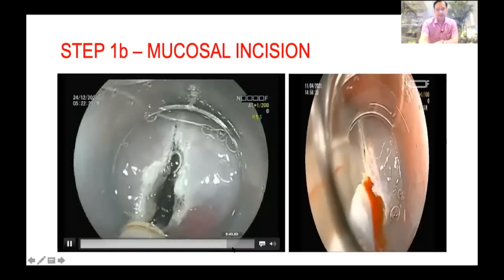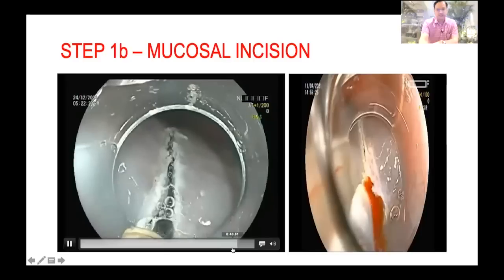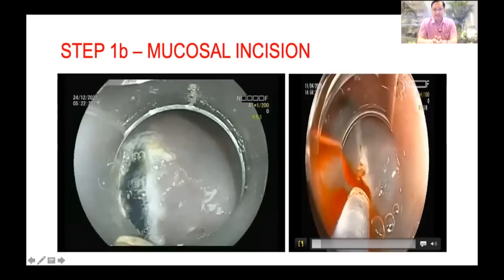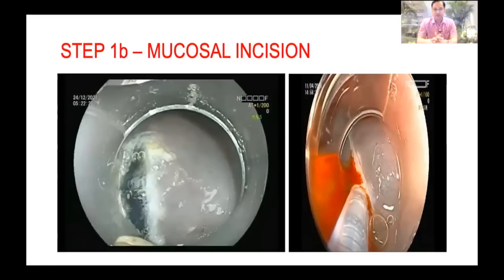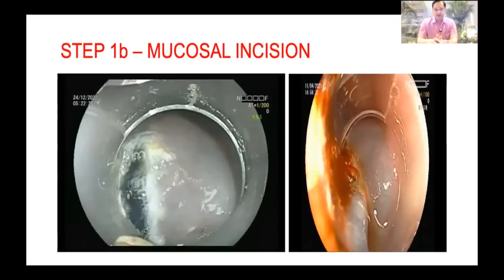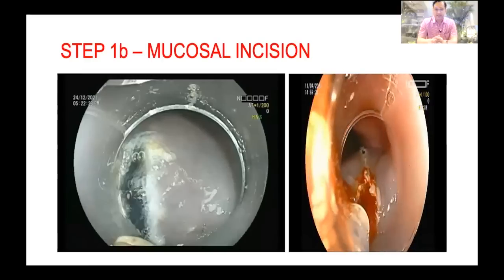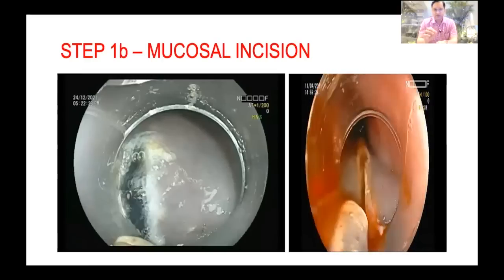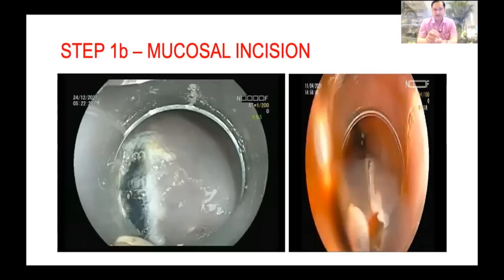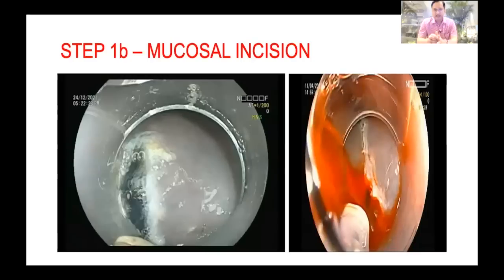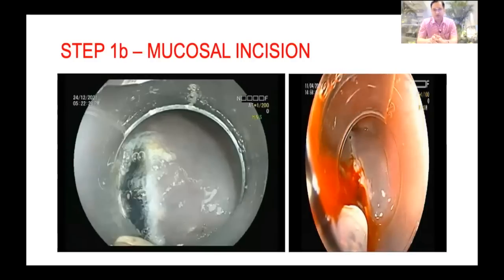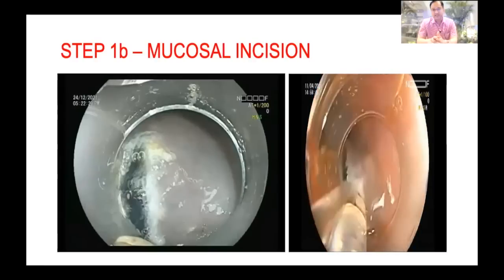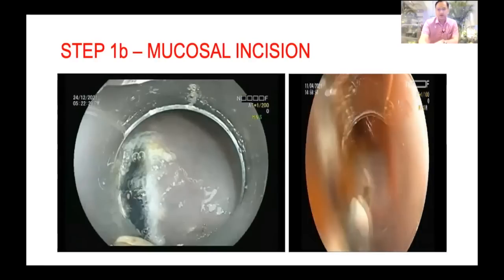Now you can see the absolutely clean mucosal incision. Sometimes you can face significant bleeding from the mucosal margin. Then first irrigate with saline with indigo carmine to exactly identify the site of the bleeder. Here I am irrigating, and now I identified the site and applied a few strokes of coagulation current — the bleed immediately ceases. After coagulation, there is no active bleed.